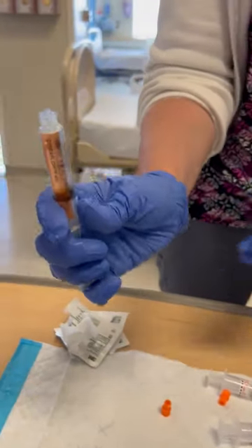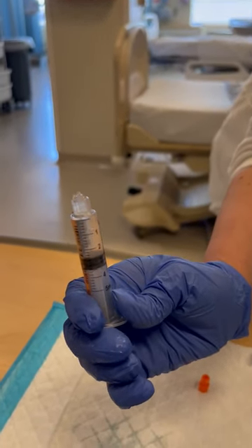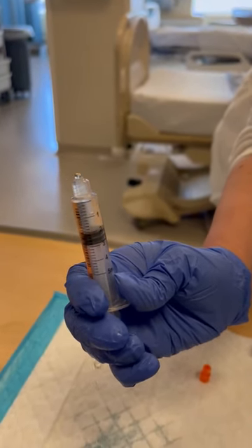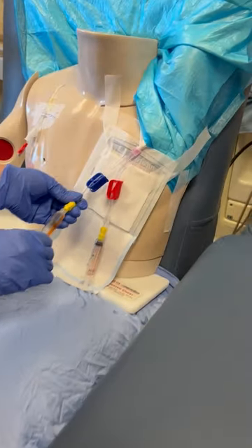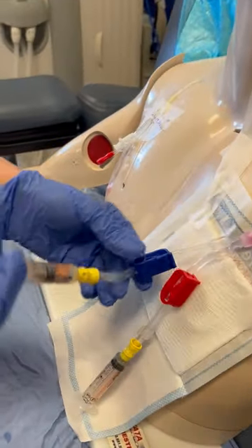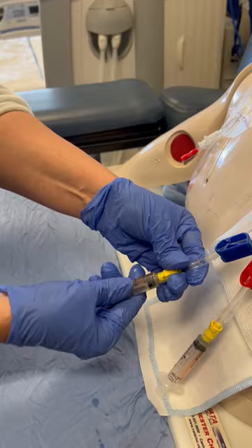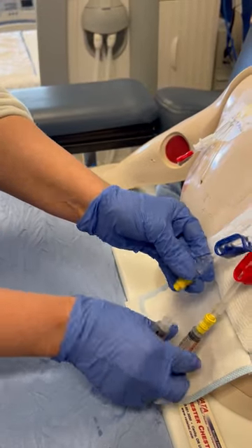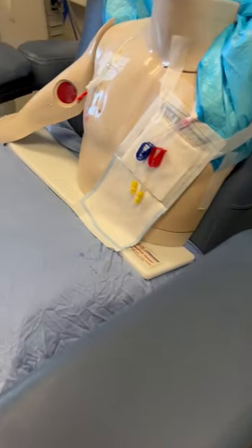Removing all air bubbles and pushing out until we only have 2 ml left in the syringe. Then go ahead and remove the syringes. And that's it.